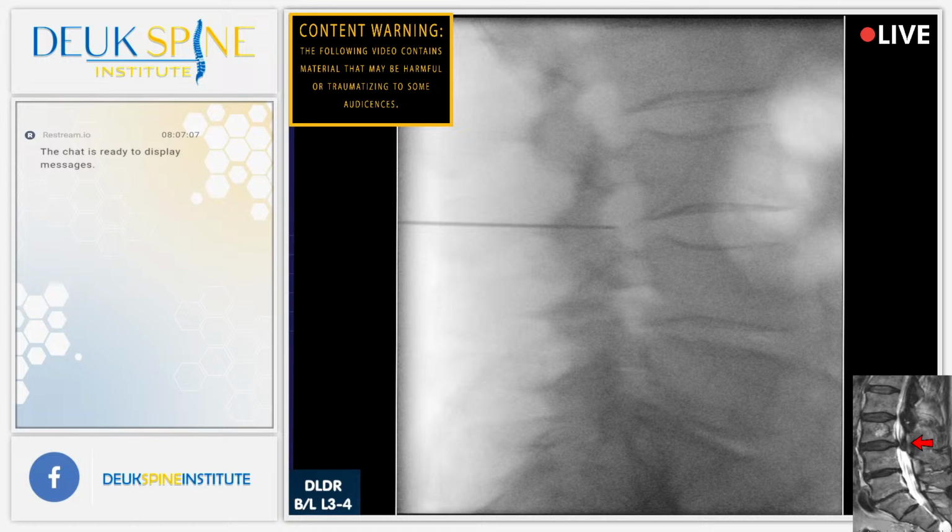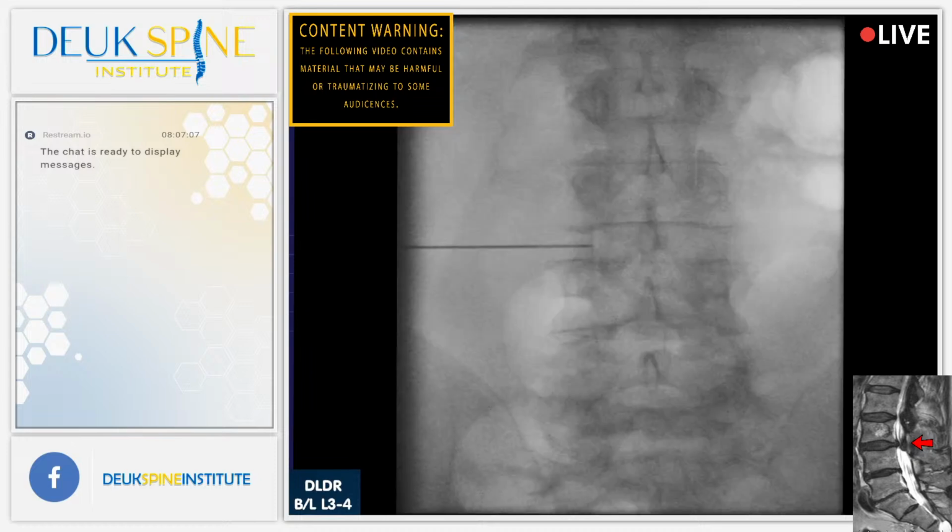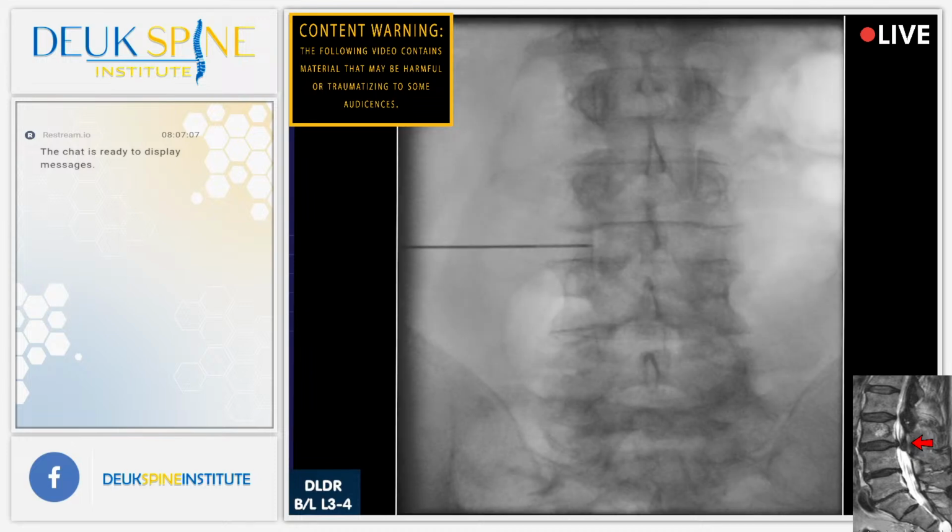I'm not done yet, but we're close. So far, things are looking good. How's our patient, doctor? You see the AP view, we're right at the back of the disc with the needle. Is he awake? All right.